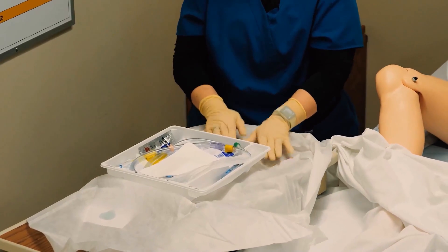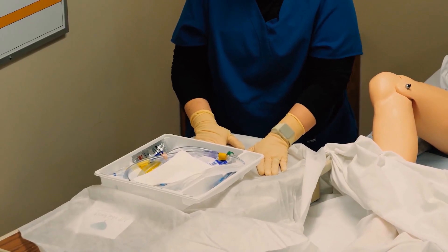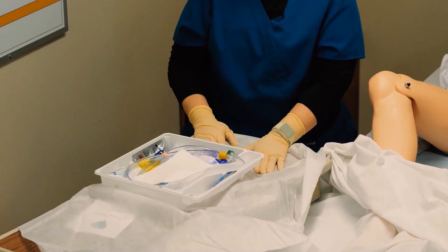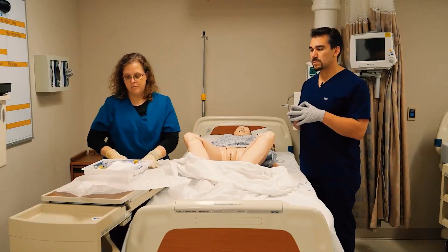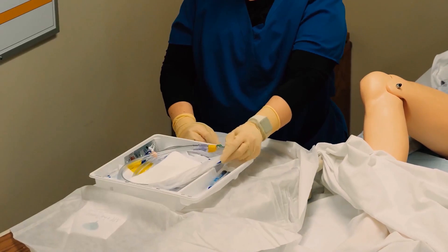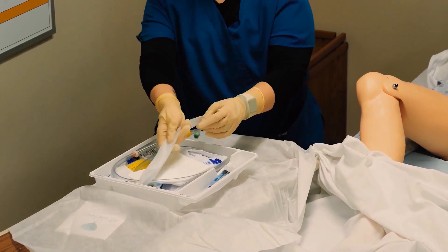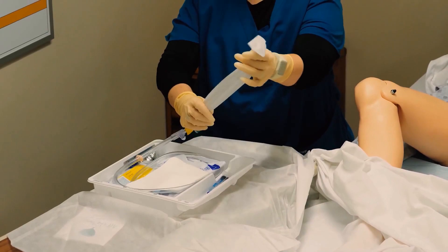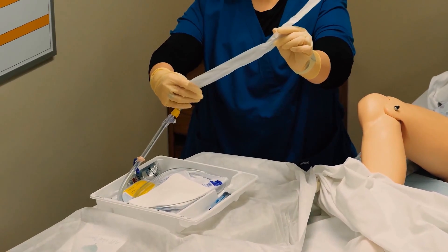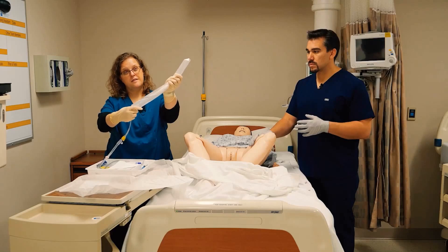Now I'm sterile, and this field is sterile. I can do anything I want to in this space, except reach over the top. I can touch any of this that I want to. I'm going to take a minute and look at my kit, because the patient's not going anywhere. This catheter is covered up, and I can go ahead and take that cover off.